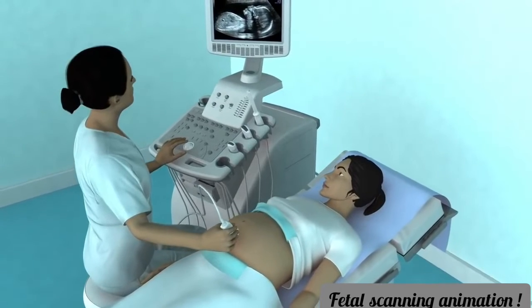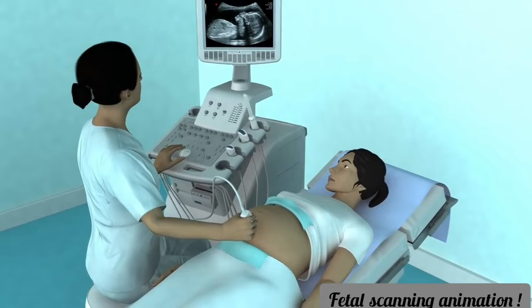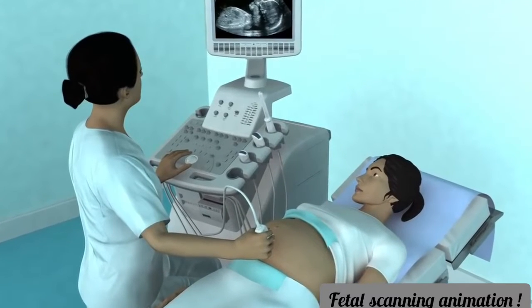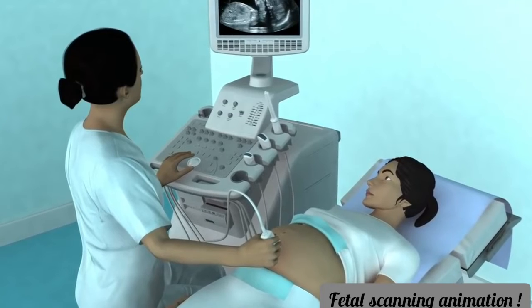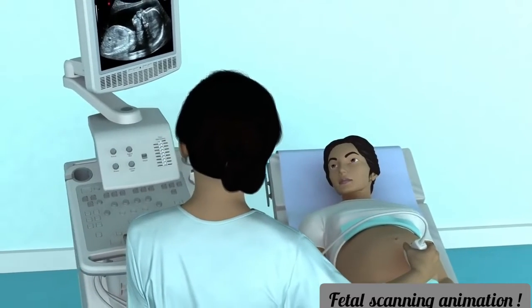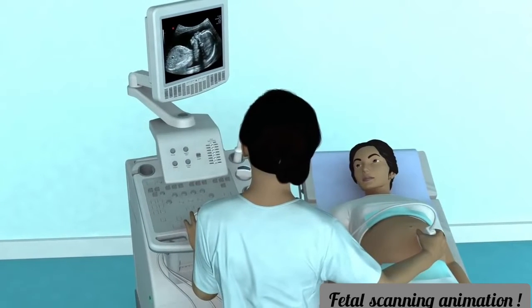This film will show you how to prepare for scanning, how to examine and measure the fetus using both a standardized 6-step approach and part of ISUOG's 20 planes and 2 sweeps approach, and finally, how to provide aftercare for the woman. The examples used will incorporate pregnancies of different gestations to best illustrate the specific steps of the scanning procedure.